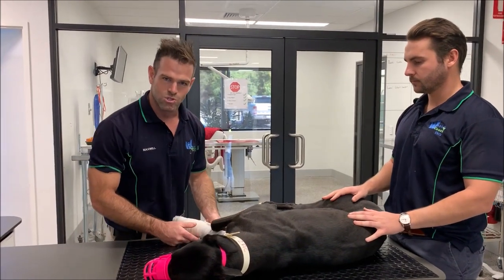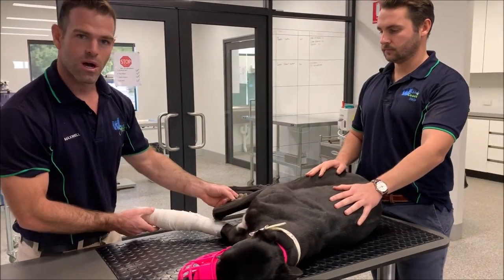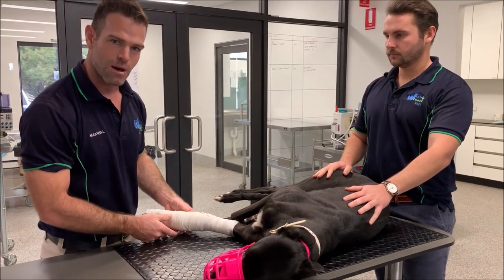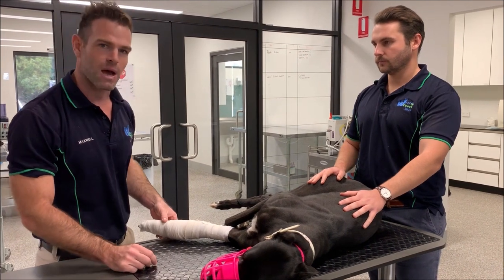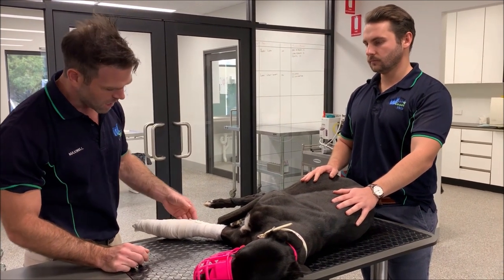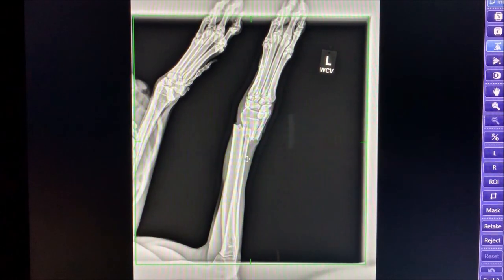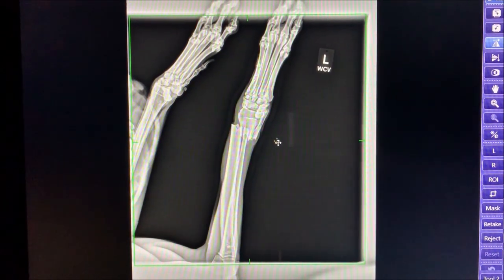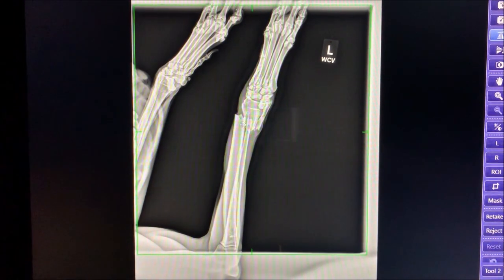This is the greyhound I was just talking about. We've got the leg here stabilized — apparently there's a very bad carpal fracture. Joe's just carried him in, so what we've got to do is get some pain relief into him straight away and we'll get some x-rays to see what we've got. You can see there's a very bad fracture of both the radius and ulna, just above the wrist of the dog.